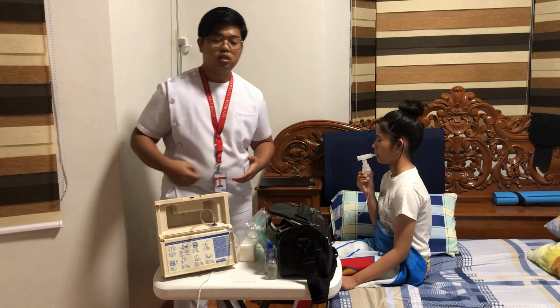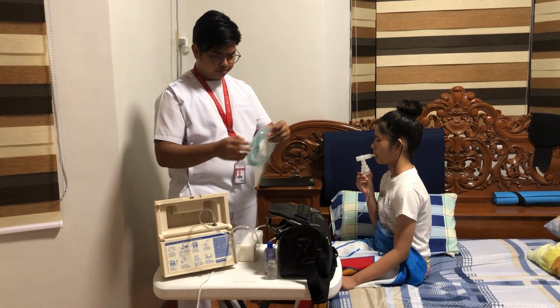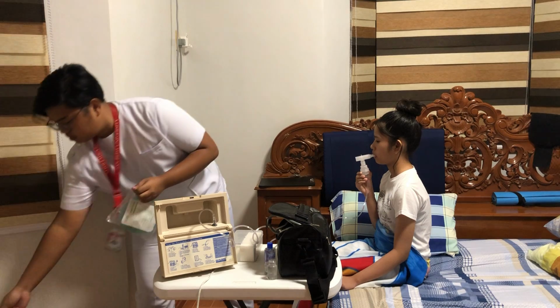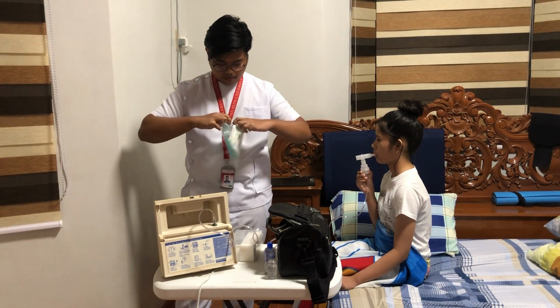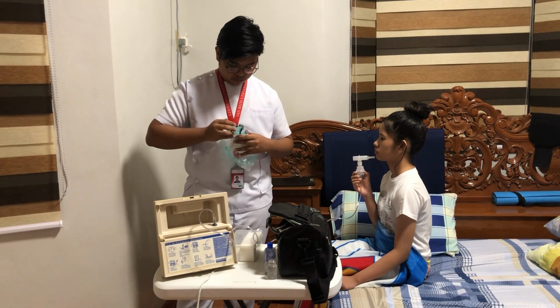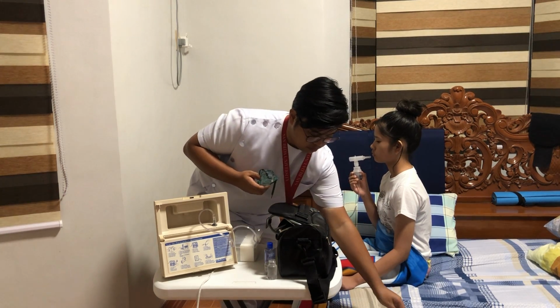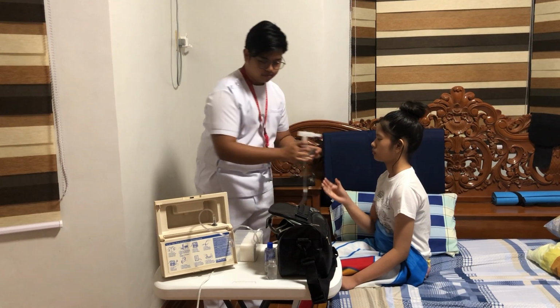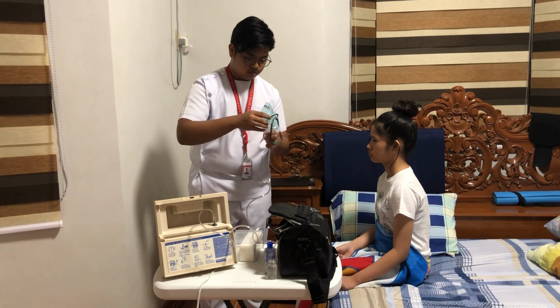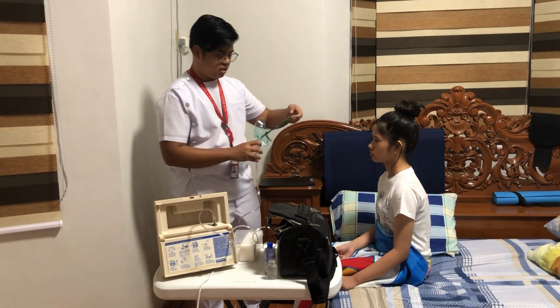And then after that, we're going to try also the mask, which we have here. Remember that this area is a sterile field, so it is okay to put down some equipment.